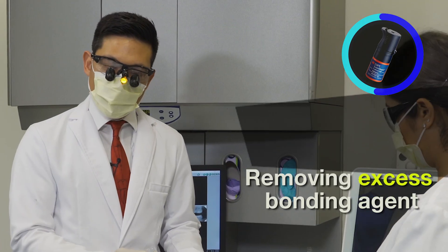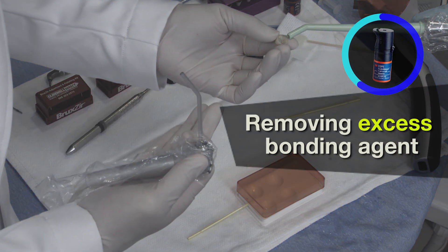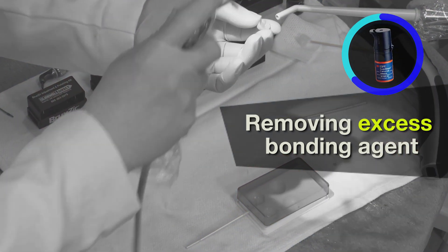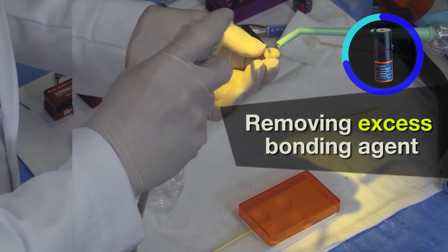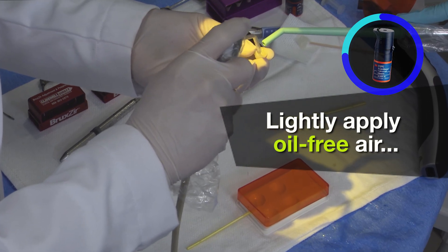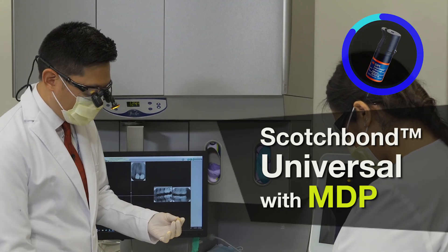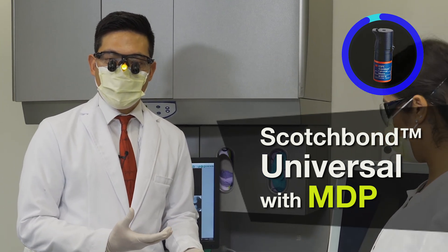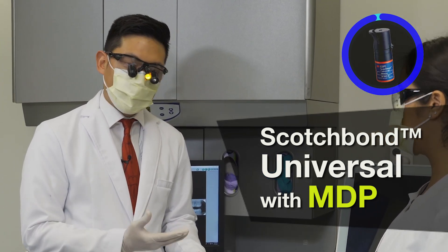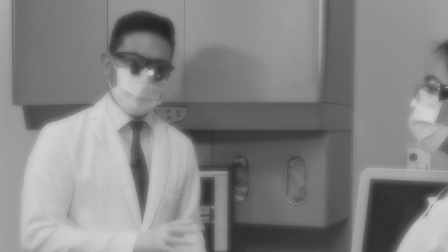Something that we do is we'll use a suction to remove some of the excess bonding agent on the restoration, and also with oil- and water-free air we're going to lightly apply some air to continue thinning out this bonding agent. The resulting layer will certainly be the bonding agent, and within this universal bonding agent — Scotch Bond Universal — there is the MDP primer which is critical for our bonding to zirconia.